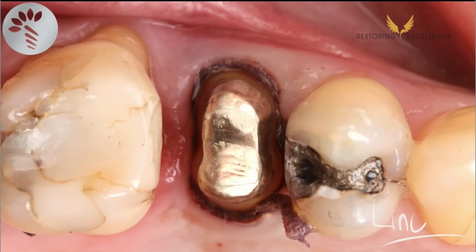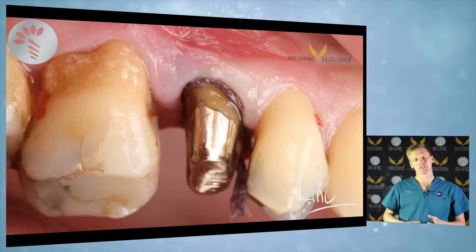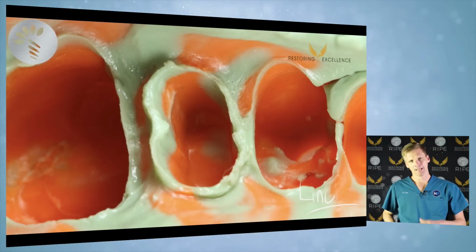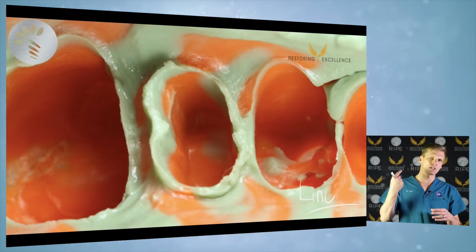But once again, thin cord packed in there, thick cord, and sometimes after the thick cord is in, you need to put cotton as well and wait even for the impression. Okay, but then we got the impression. This is a vertical preparation, so once again, you're trying to capture something quite subgingival, even though the crown won't necessarily go that deep. So you start to see it's just a routine.